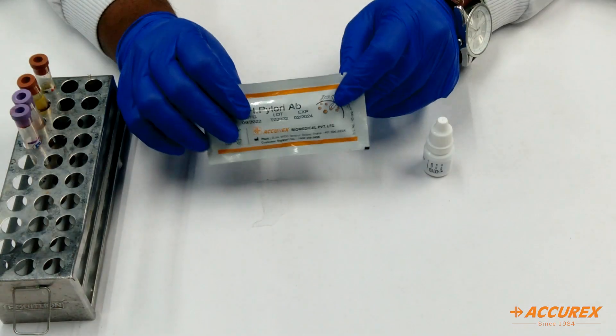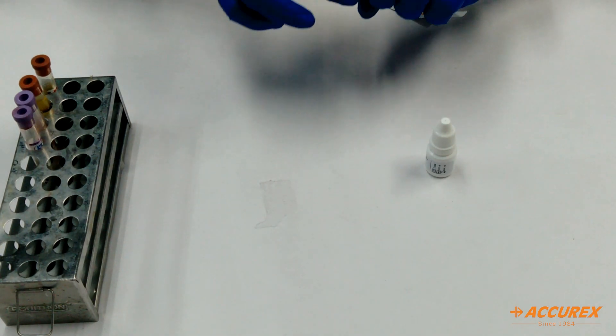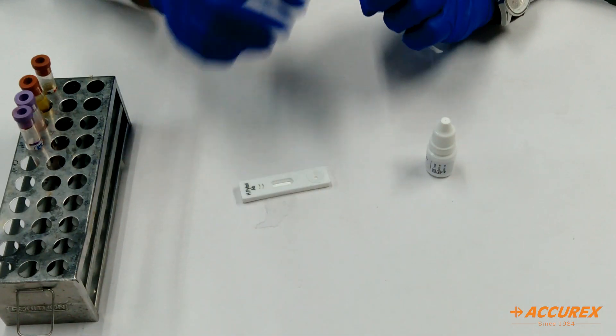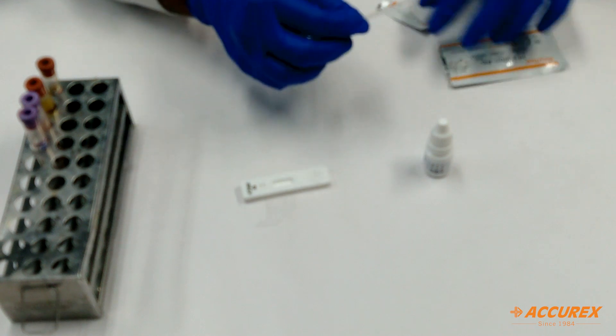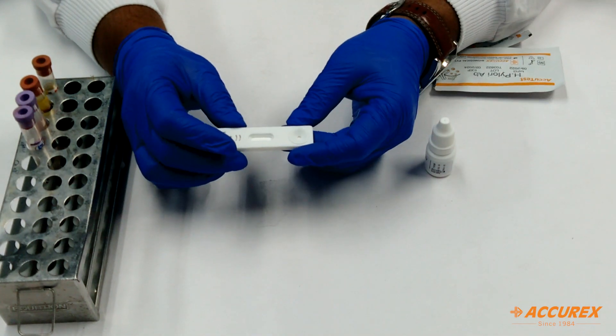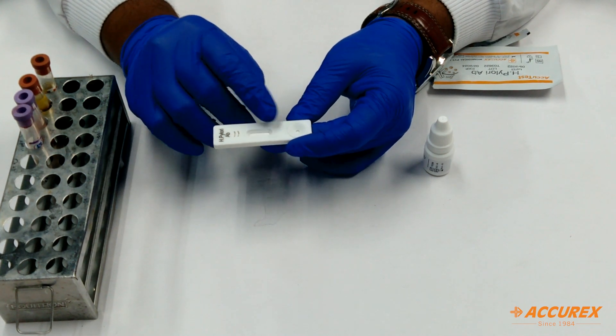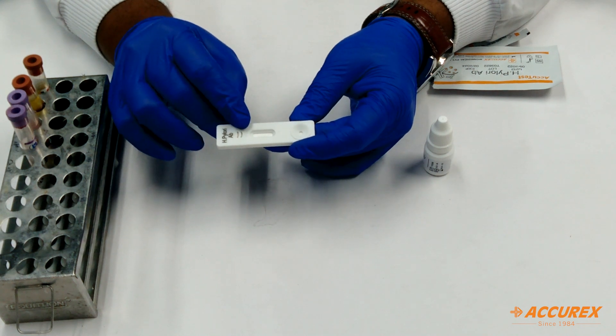We will see how to use this card. I have taken one card from the box. You can see there are two windows — one is for the sample and the other is for the test results. T means the test line and C means the control line.